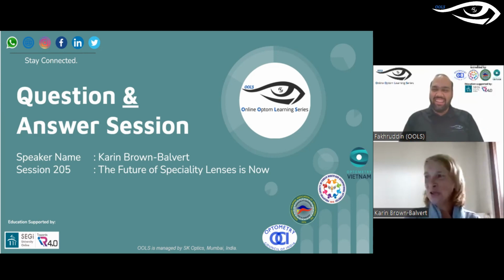And you saw John Samseli, who's one of our users. His patients travel sometimes 5-6 hours. One of them had to come, I think, from the States back to Nigeria, and the same in the States, and I'm sure it's the same in India, that people travel 5-6 hours to get to their opticians to get scleral fits. In the UK, that probably would be unheard of. Actually, they probably do about 3 or 4 hours of travel for that. So yes, super important to make sure that you've got a good scan before the patient goes.